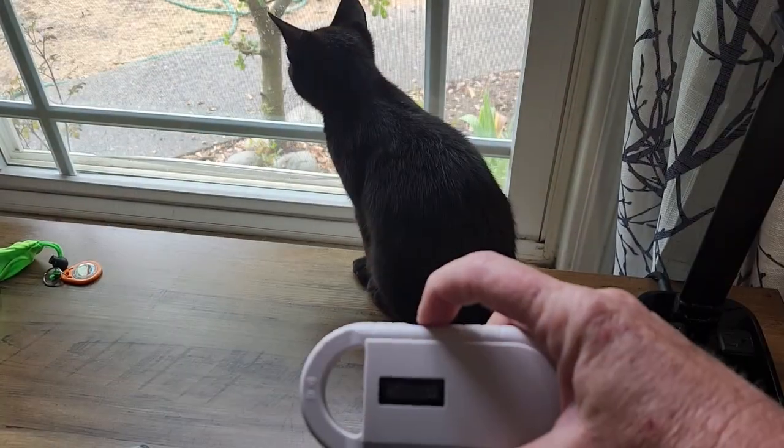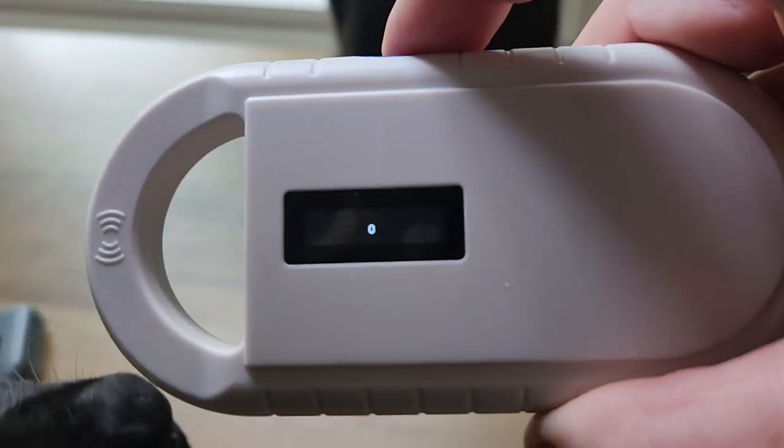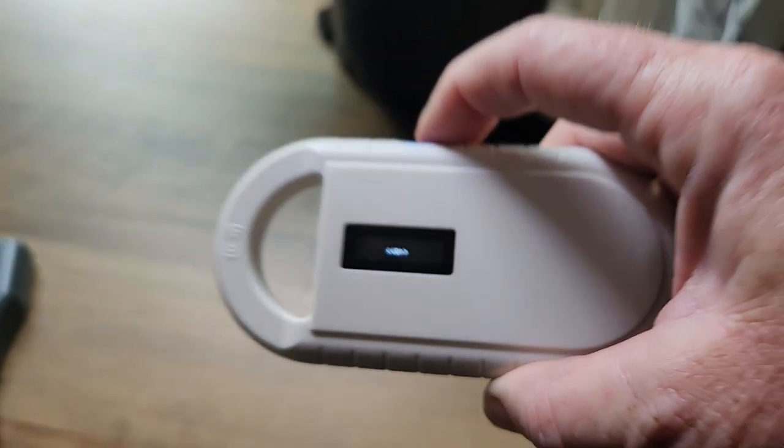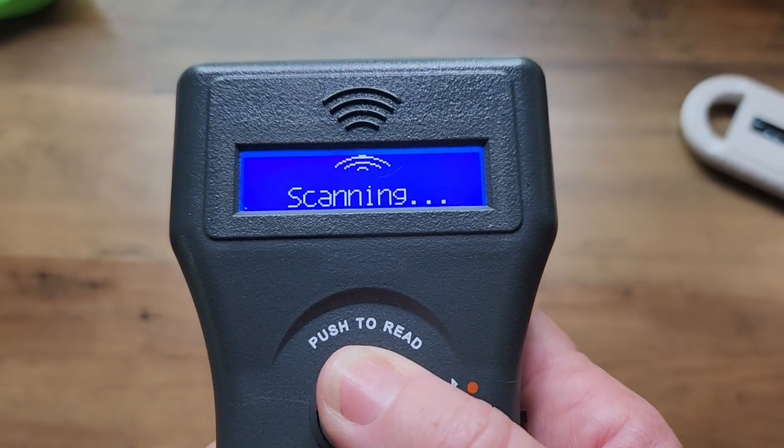Number three: push the scan button in accordance with your particular scanner. Many scanners let you take your thumb off and they'll continue scanning — you can tell because the screen will say 'scanning' or show a moving arrow. Others require you to hold the button down and stop scanning when you release it. Before you use it, be aware of how your scanner works, otherwise you won't get an accurate scan.